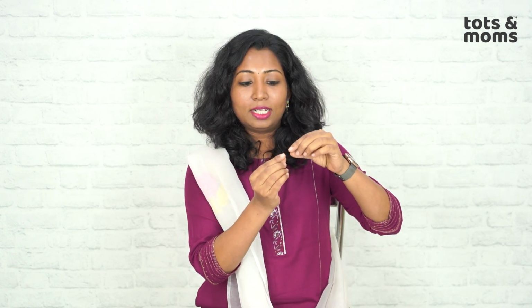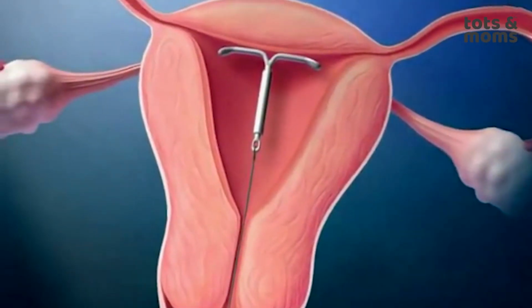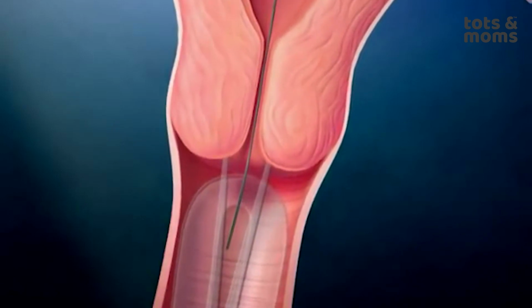Now this, while inserting, is just a small stick inserted in the rod, and then when it goes inside your uterus, it opens up horizontally like a T-shaped one, and the string is left inside your vagina. It is not very painful, but you may feel a slight pain and cramps after insertion. You can do your routine work, you can go back to office or your home and continue to do things, but the doctor would advise you to be a little careful in the initial days, because you may see some spotting as well, and meet the doctor after a month or so.